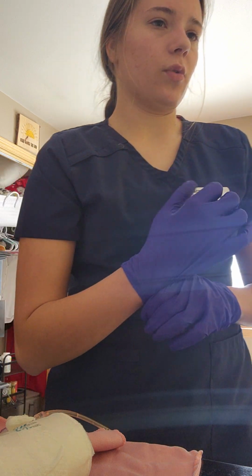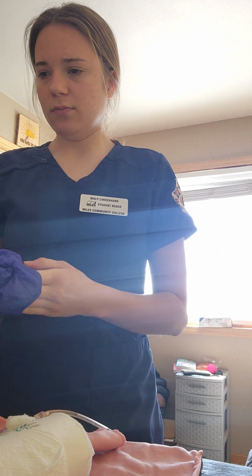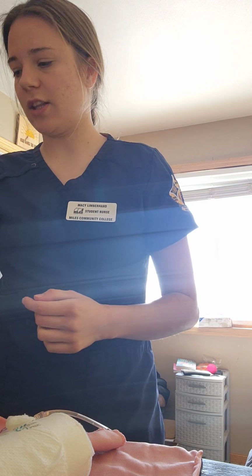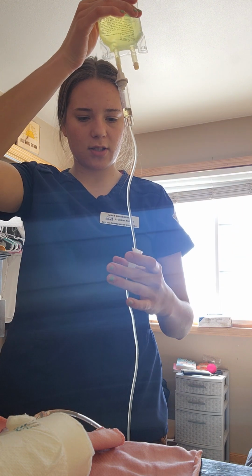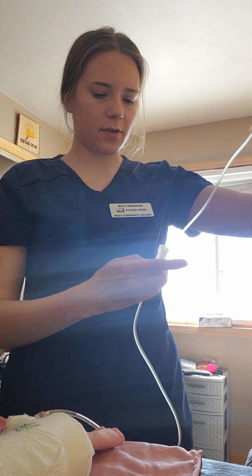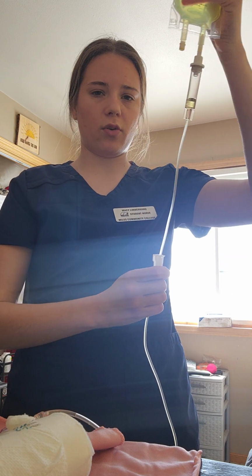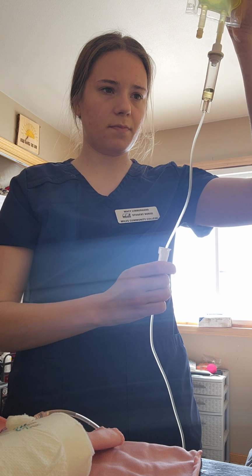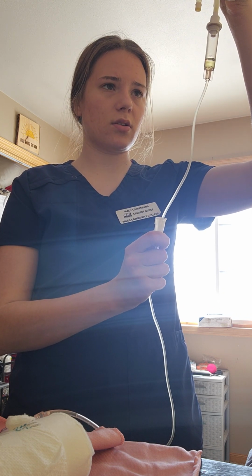Okay, and then I'm going to go ahead and set my rate. So I have calculated that I need 11 drops per minute. So the way I'm going to do this is this would be hung, but it's not. So I'm going to look at my watch, and I'm going to count out 11 drops per minute by rolling up this.